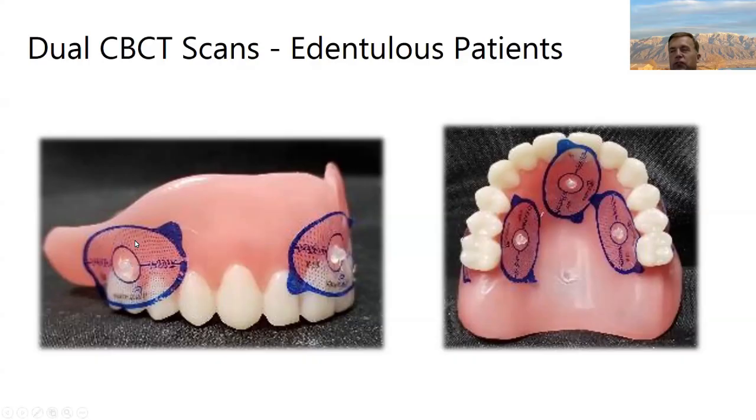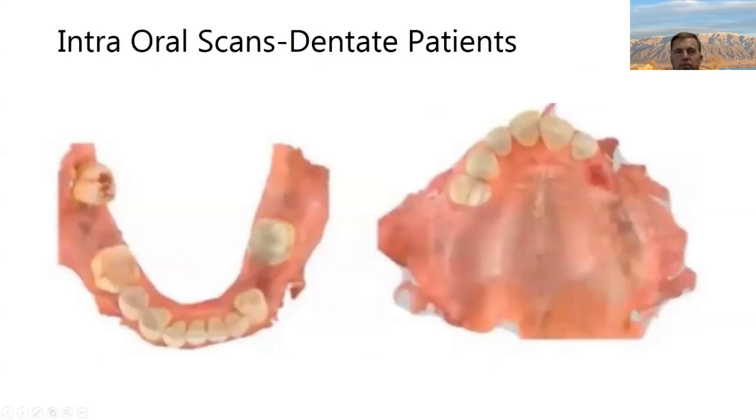But anyhow, once you've gotten that first scan, then you can put the denture in the mouth and have the patient close. Dentures are radiolucent, so they don't create a lot of scatter. So you can go ahead and have the patient bite into CR, and we can actually use that as a bite registration. So if you're doing a double arch case, a person who has double arch dentures, you'll do three CBCT scans and then take an IOS of the tissue. If it's a single arch denture, you'll do this reference denture scan, and then you'll also do an IOS scan of the opposing and the bite and the tissue as well. You can use this double scan workflow with a bite block if you want.